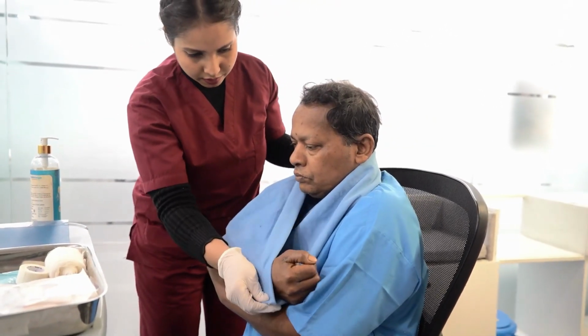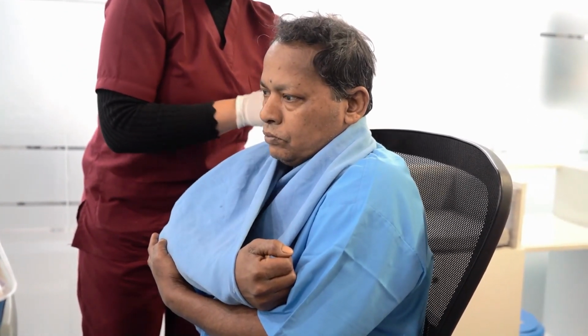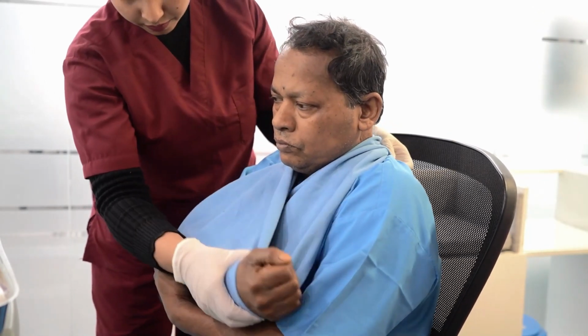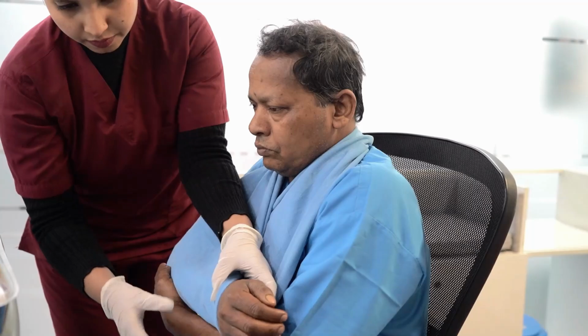Tie the two ends of the bandage together in a reef knot above their collarbone and tuck in the free end. Adjust the sling so that it supports their arm all the way to the end of their little finger. Make sure that the edge of the bandage by the elbow is secured by twisting the fabric and tucking it in, or using a safety pin to fasten.